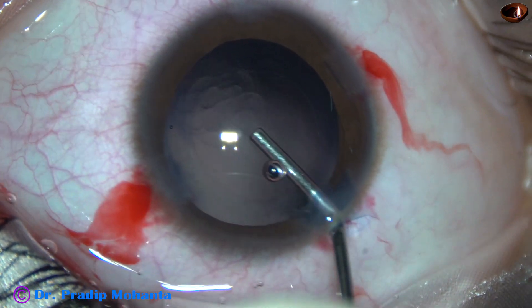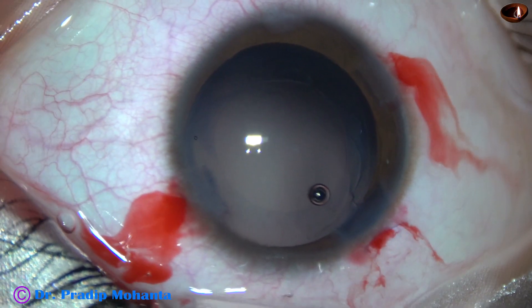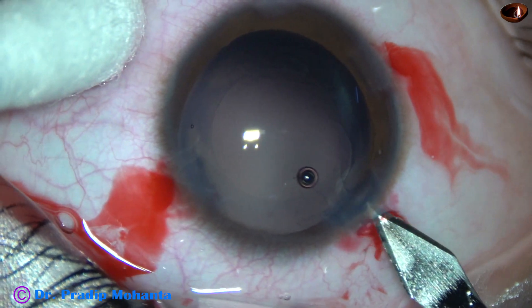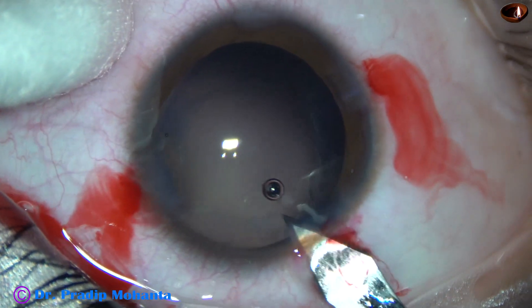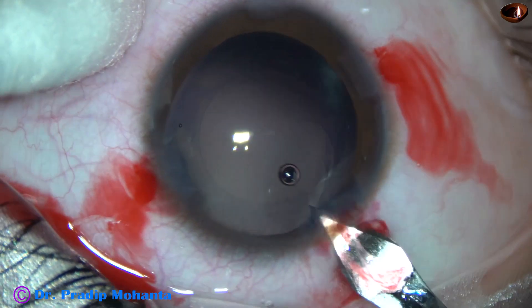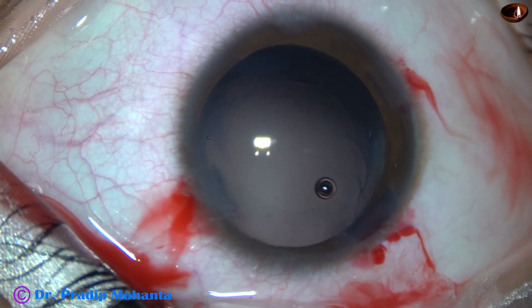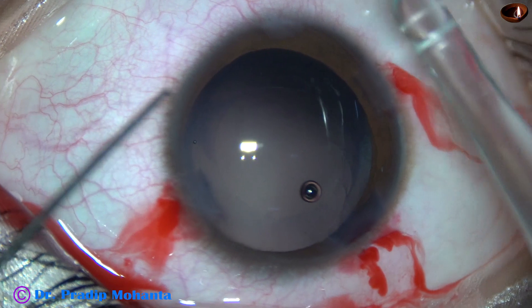Visco again fills the capsular bag and the anterior chamber. In this case I am going to use a B cartridge, so I am going to enlarge the main wound to about 3 mm. Since the wound is on the sclera just behind the limbus, even this 3 mm wound will not require any suture.